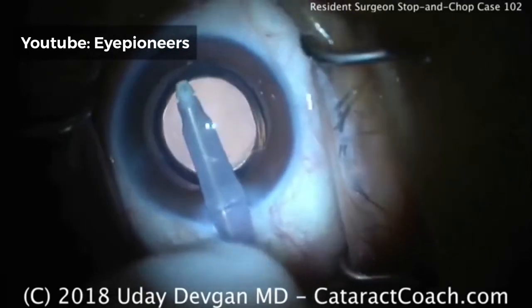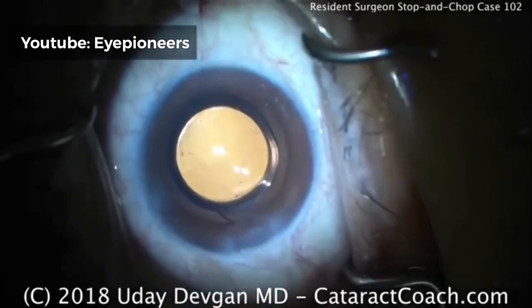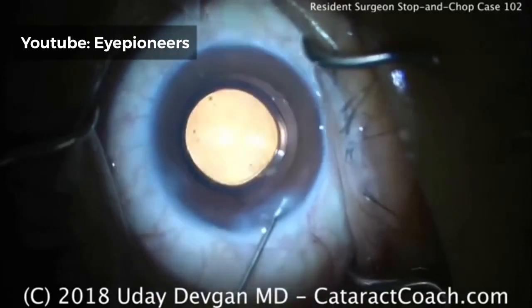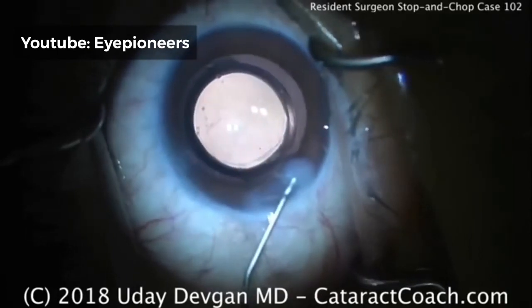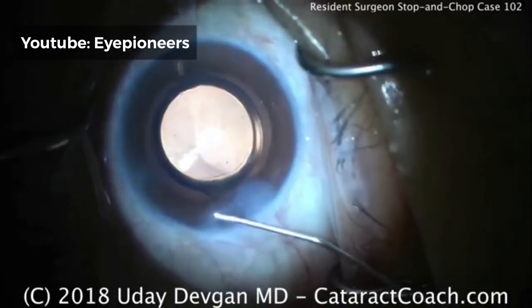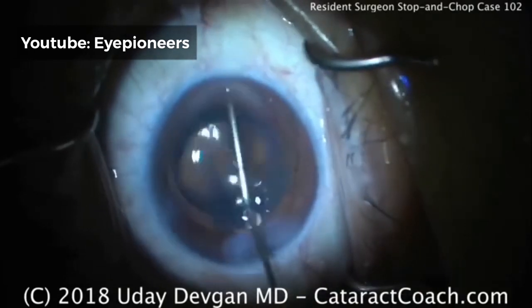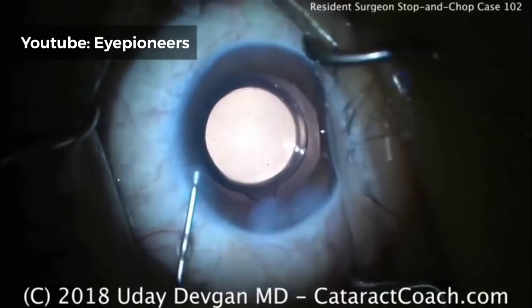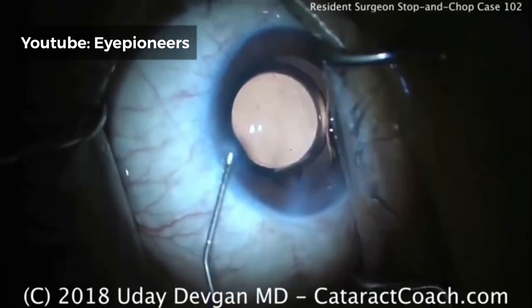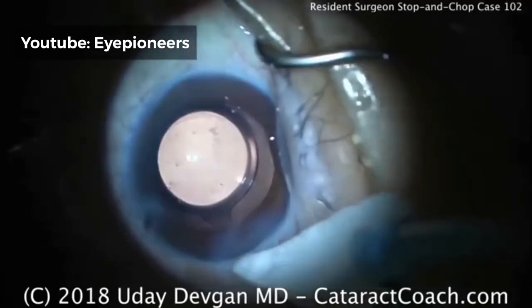Time to remove our viscoelastic. Early in the learning curve, I don't ask residents to go behind the IOL — just move from in front of the eye and rock the optic back and forth to give a little more exposure and flow to wash out the viscoelastic. Here's the corneal hydration. I don't particularly like this technique of hydrating only the corners of the incision; I prefer to hydrate mid-stroma back and forth so you have strong hydration right in the middle of the incision. The paracentesis is hydrated as well. The incision was very well constructed so I don't anticipate any leakage issues.